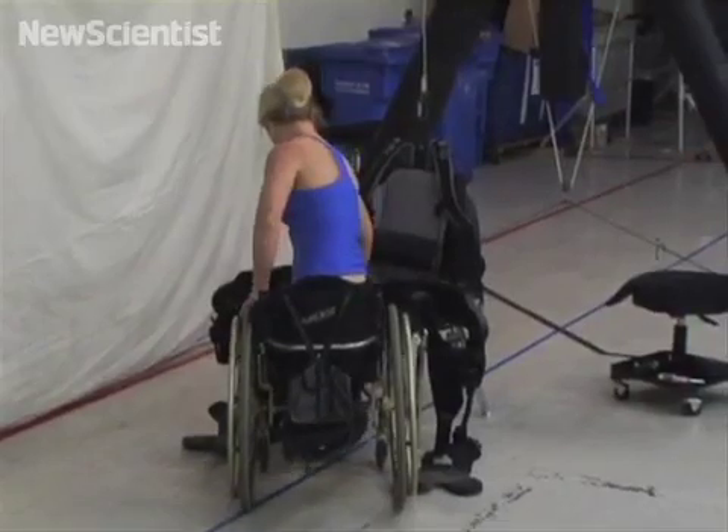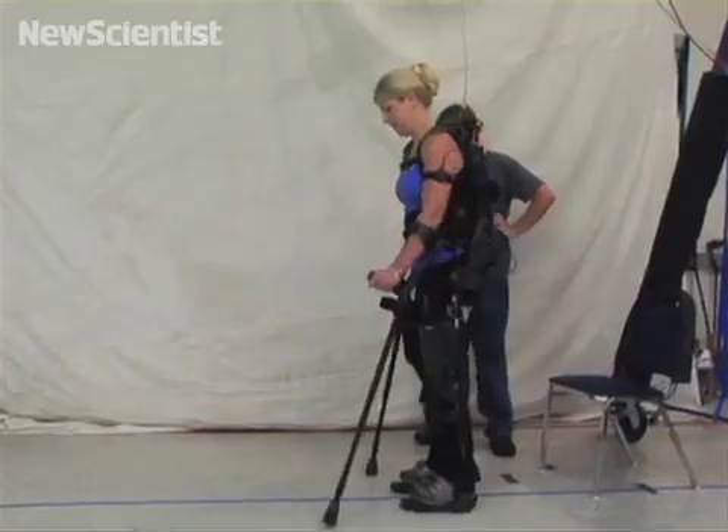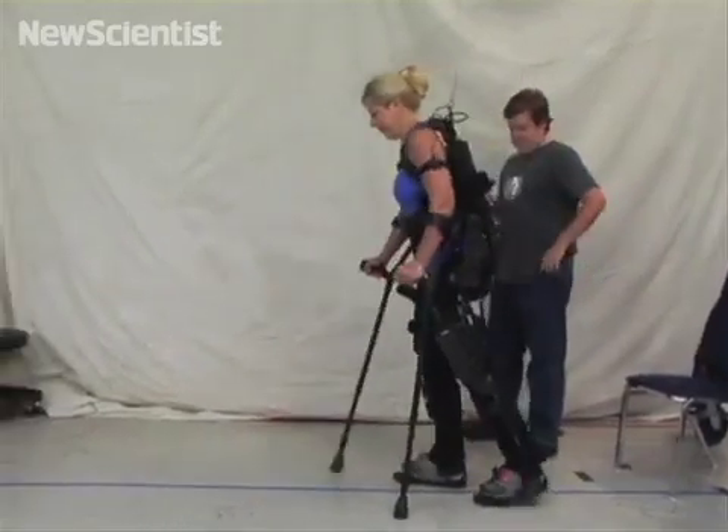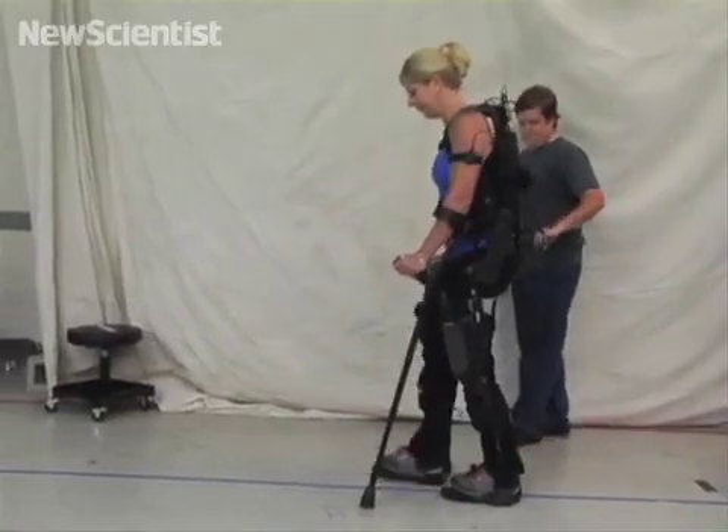Unlike previous exoskeletons, this one is easy to put on without help from others. Sensors in the crutches and armbands detect what the wearer wants to do — pushing down on the left crutch, for example, allows the person to step with their right foot.